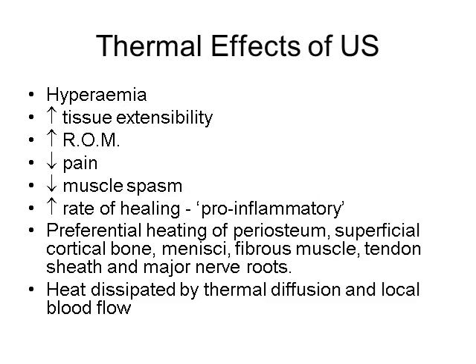Ultrasound, because it may cause heating, is reported to have the following thermal effects. These are similar to the effects of other forms of heat described in an earlier lecture. You will see that there will be preferential heating of tissues with a high acoustic impedance, such as bone and periosteum and the tendon sheath. Any heating produced by ultrasound will be slowly dispersed by a process of conduction through the tissues and by blood flow.